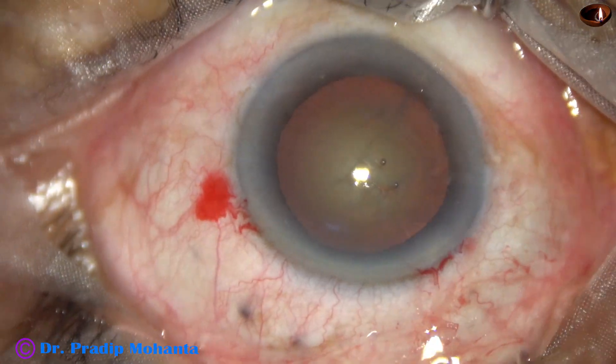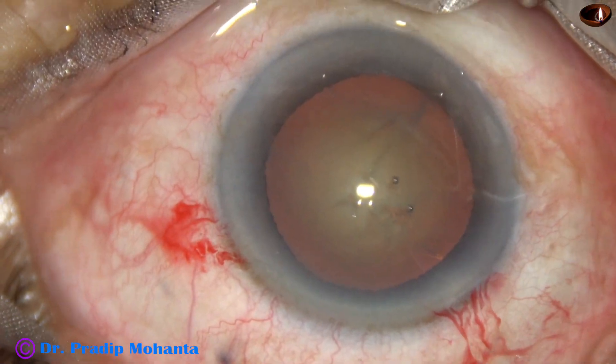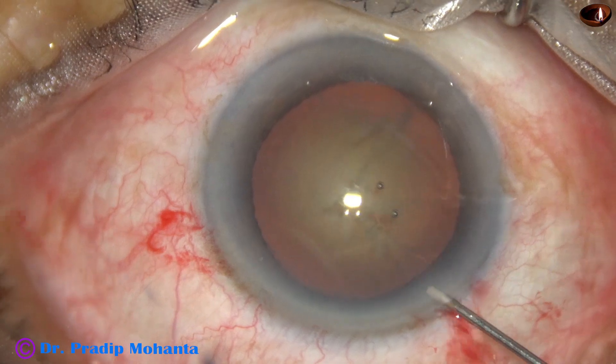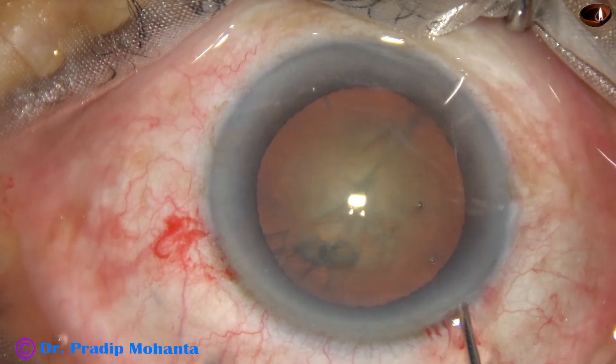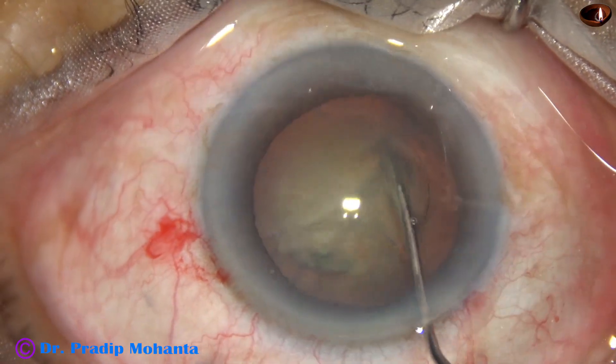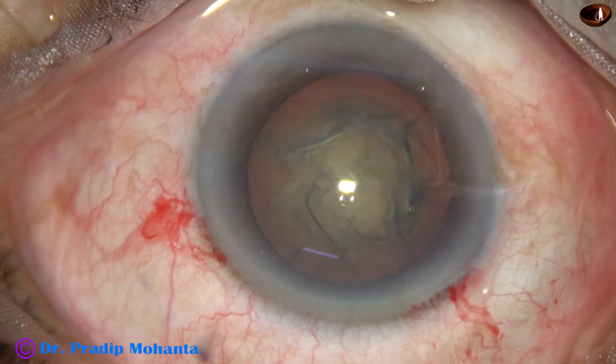Hydrodissection is done using BSS with a 27 gauge cannula, performed nicely. Next, the nucleus is rotated.